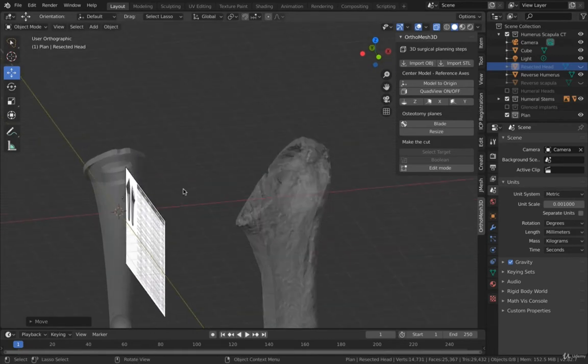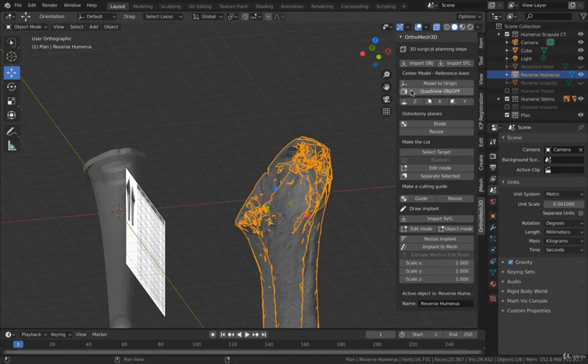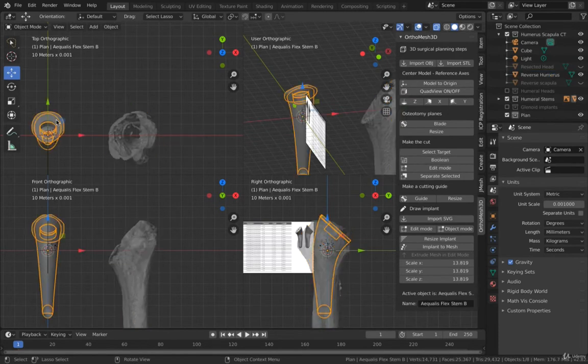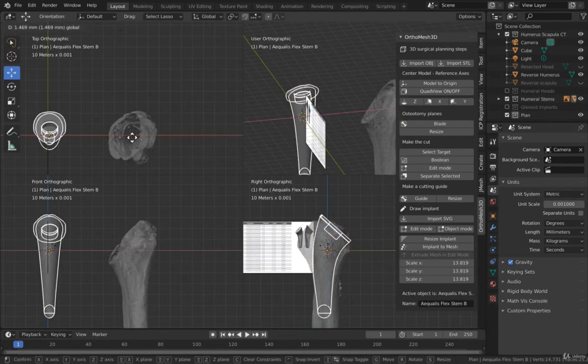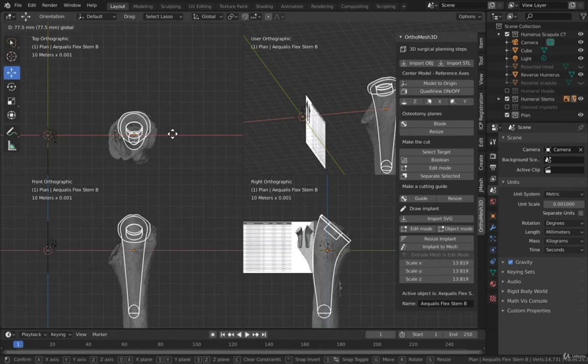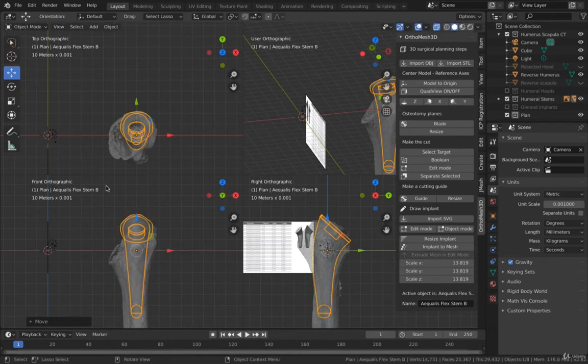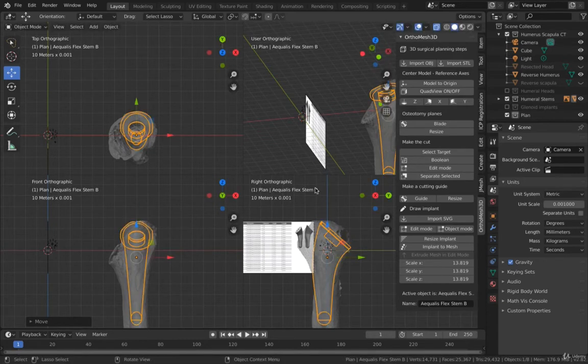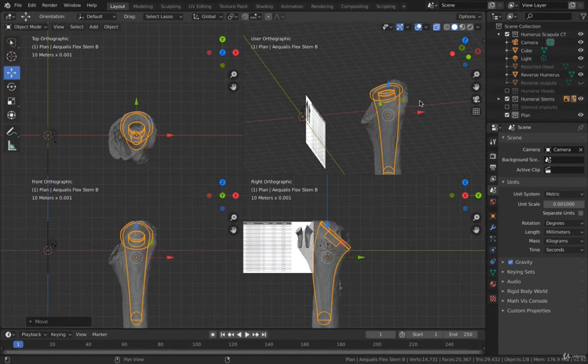Now I have to put the stem in the humerus and trial, and the way I would do this, I will click on the humerus and go back to quad view. I'm going to move my stem closer to the humerus and try to see if I have a good fit. I'm going to move it down some, and then press N on the keyboard. Now I have to rotate it.